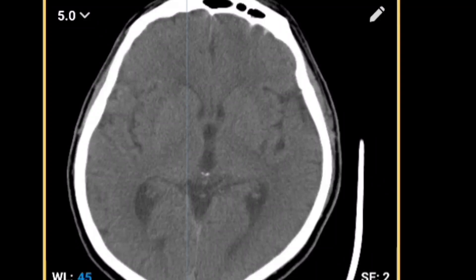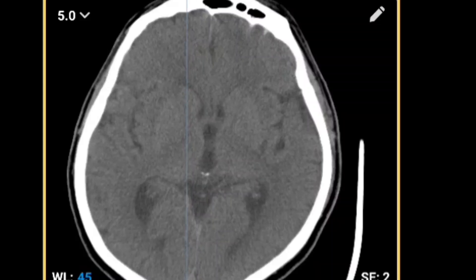Going further upward, this is the area where you can appreciate the third ventricle. Here in view you can see the posterior horns of the lateral ventricle, also called the occipital horns of the lateral ventricle. Going slightly upward, on the right and left side the sylvian fissures are visible.